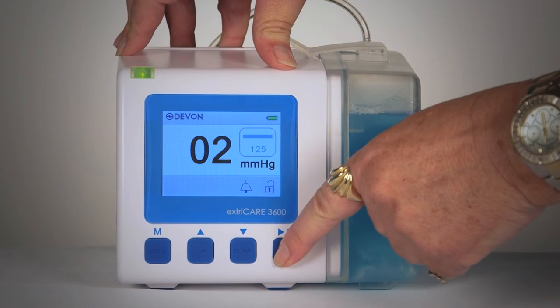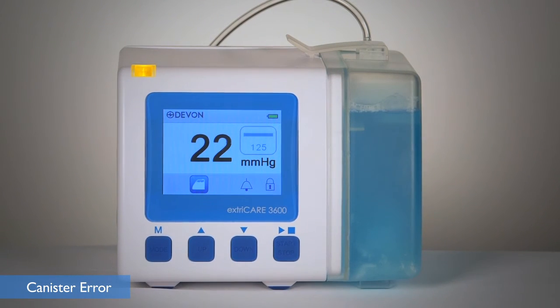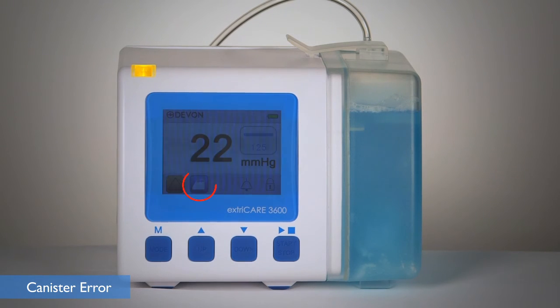The canister full error alarm will sound when the canister is full. The LED light will flash yellow and the canister full symbol will appear. The pump will shut off. Install a new canister to mediate the error and continue treatment.